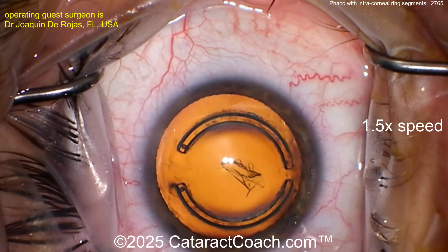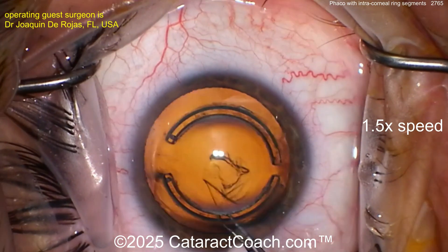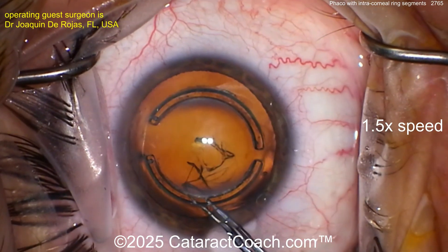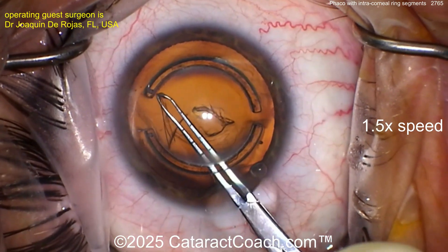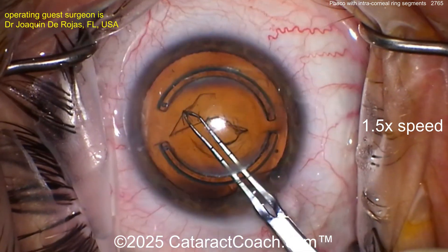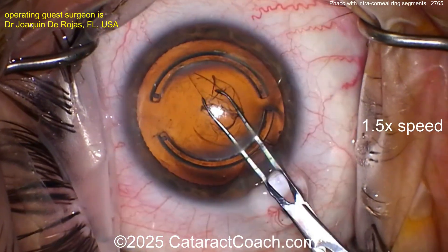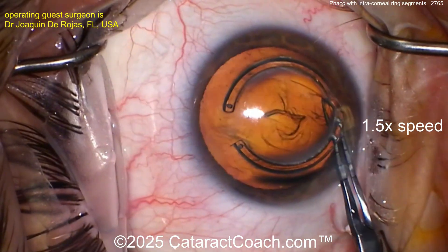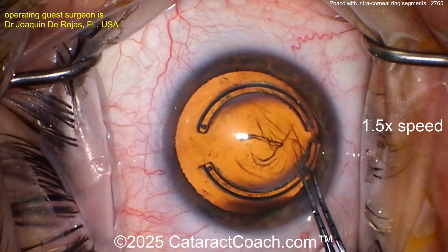Now we get that rhexis flipped over, using the forceps to get the capsulorhexis going very nicely. You want a five-millimeter rhexis. The forceps have marks at one, two, three, four, five millimeters — so you've got a full-on ruler on your forcep tips. Well done.